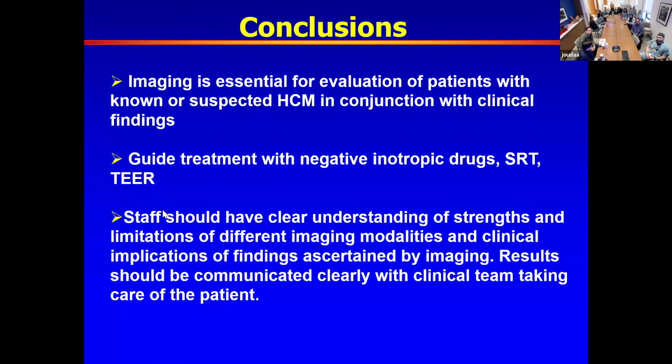Do you use a device to do your Valsalva, or just a patient instruction? Just the patient instructions. Our sonographers demonstrate to them what is a good effort and they guide them through the procedure. So Dr. Leon Poi has a question following.